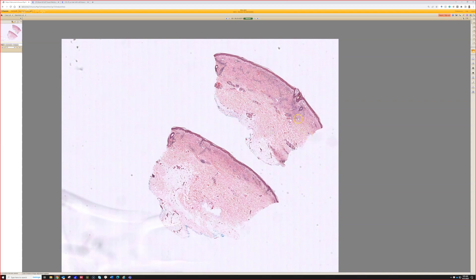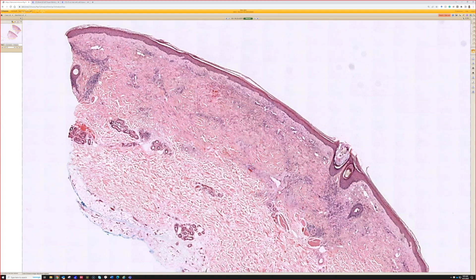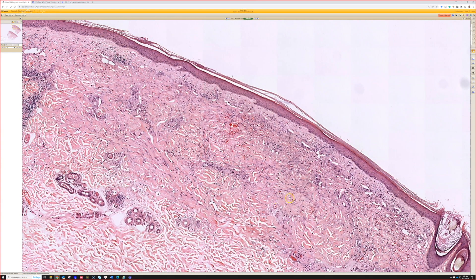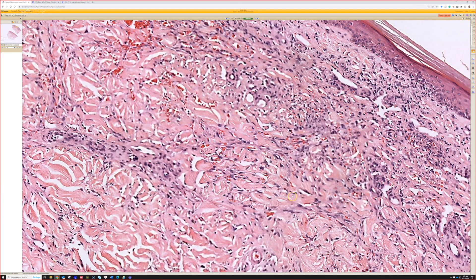We have a small punch biopsy, and you get the sense of a busy dermis, often the superficial aspect of the dermis, just some increased cellularity and maybe a little blood. And then you can start to see some slit-like vessels up top, or what look like some potential slit-like spaces, and then maybe some spindled cells kind of interstitially.